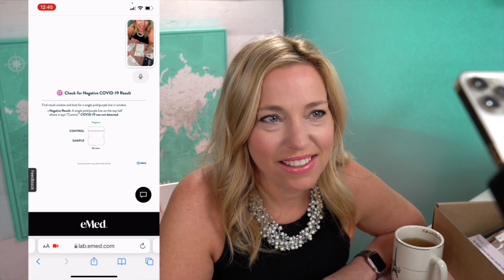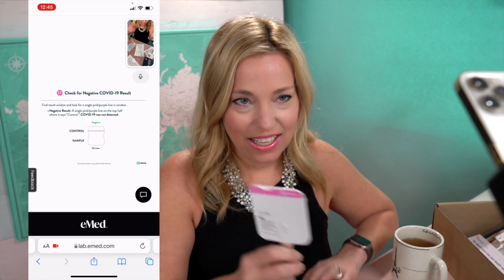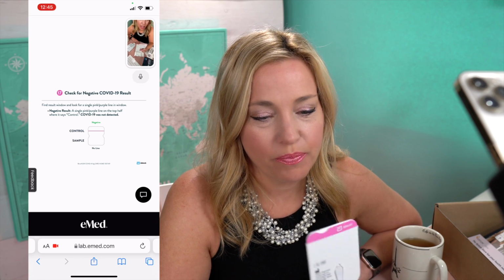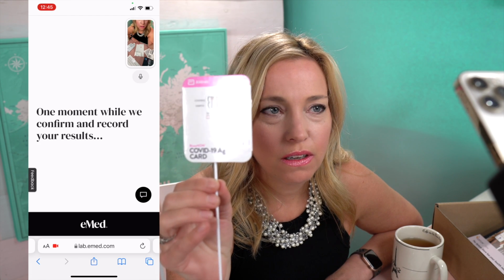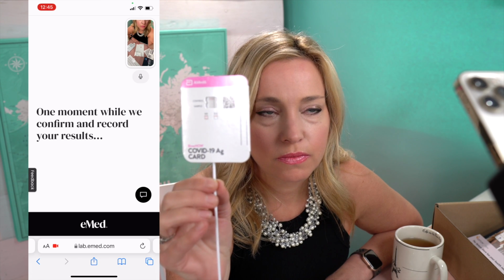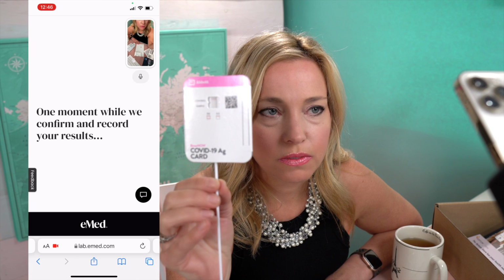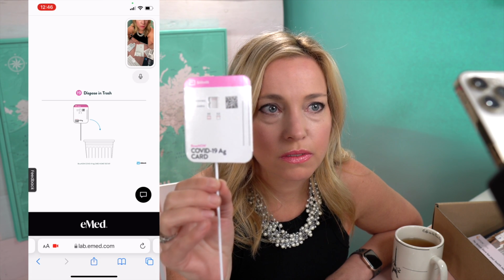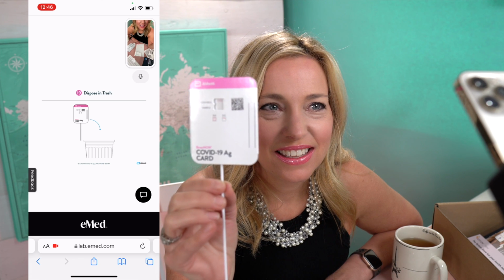Perfect, Sherry. You have tested negative for COVID-19. If you experience COVID-related symptoms, you may require additional testing to confirm that you don't have COVID-19. And if you have questions, please contact your healthcare provider or local health department. Now, Sherry, you may dispose of the card, drop the bottle, and swab in your trash. The test is now complete, and information about the test will be sent through your email. I'm going to submit your negative result, and your test result and digital pass will be sent through your Navica app, okay? Okay.